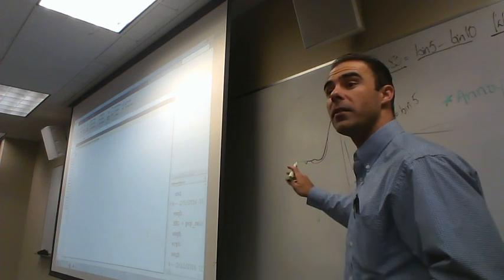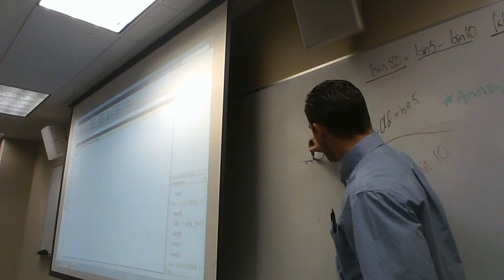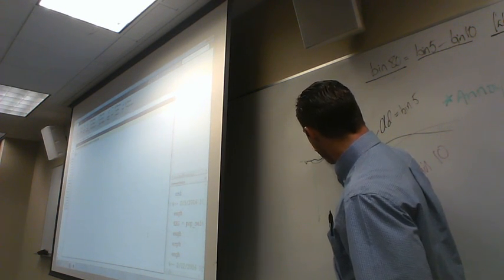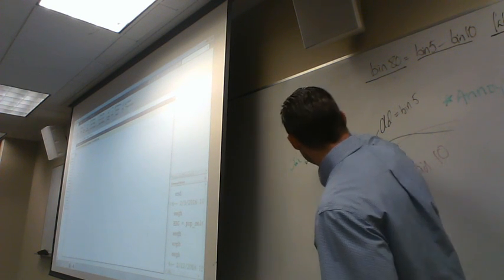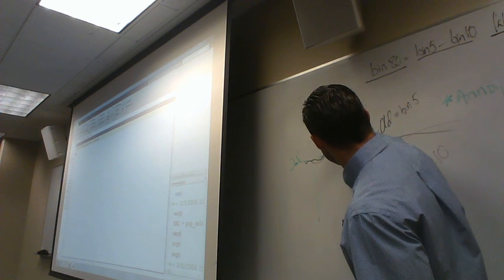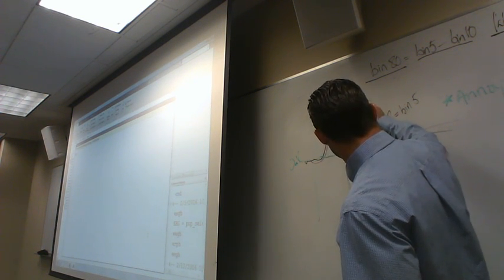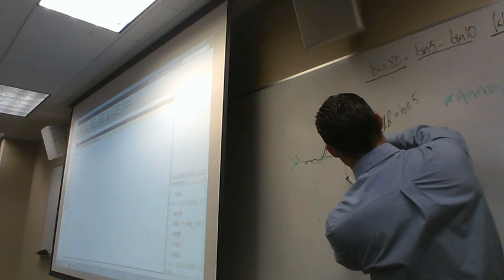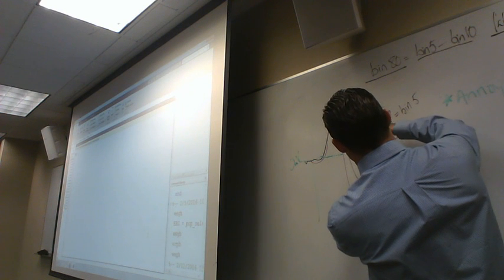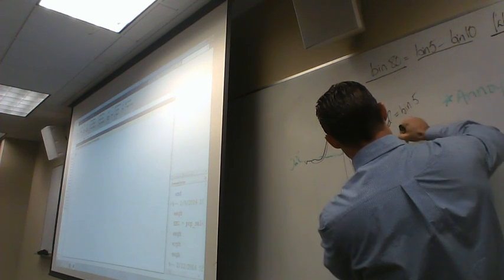So if we would plot that, this would be just a tiny little blip. It's pretty much nothing, and it's pretty much at 0, right? So this is our 0 microvolts. It's all the same, the same, the same. It starts to get a little bit bigger, right? And then now this is our biggest point, so this is our peak, and now as we come up here, these start getting smaller. So now as this comes here, we're back to this point.